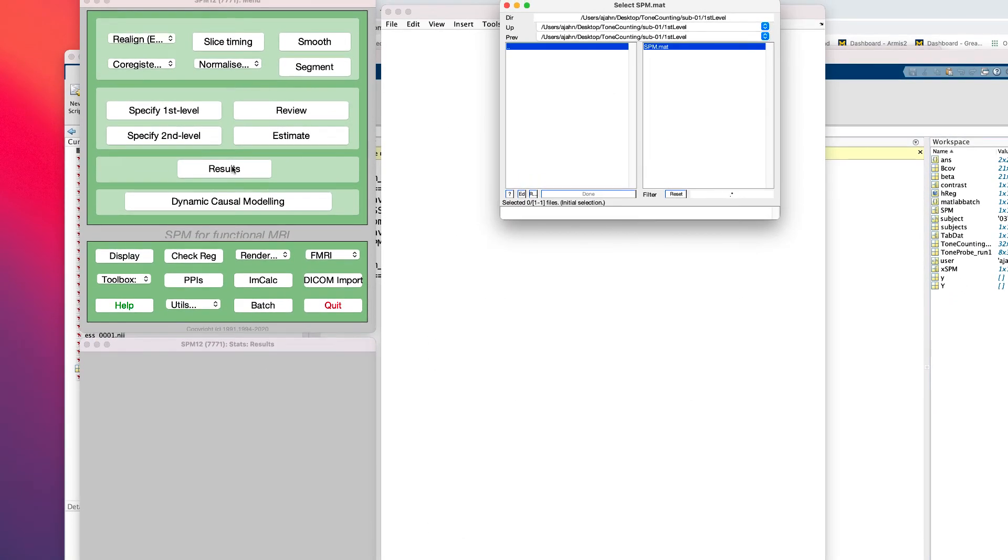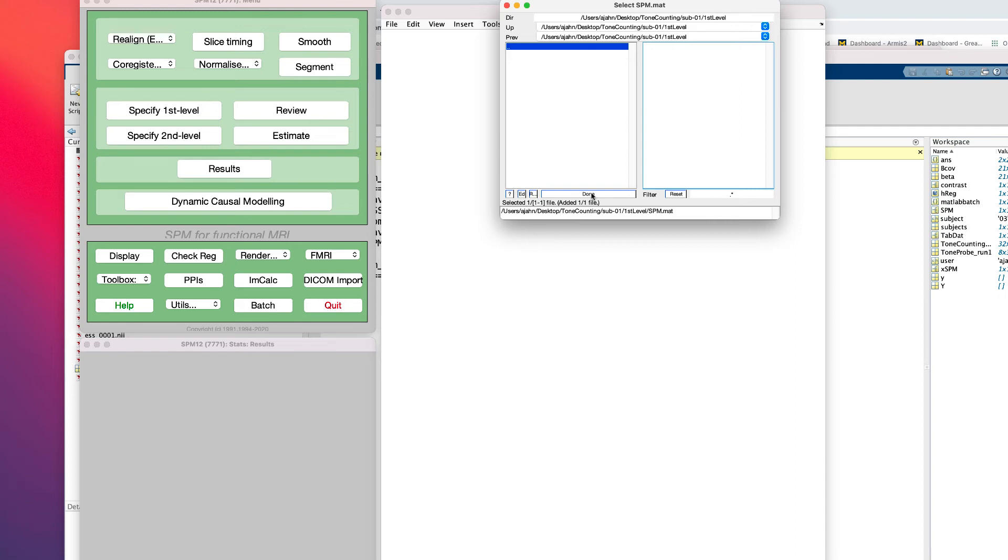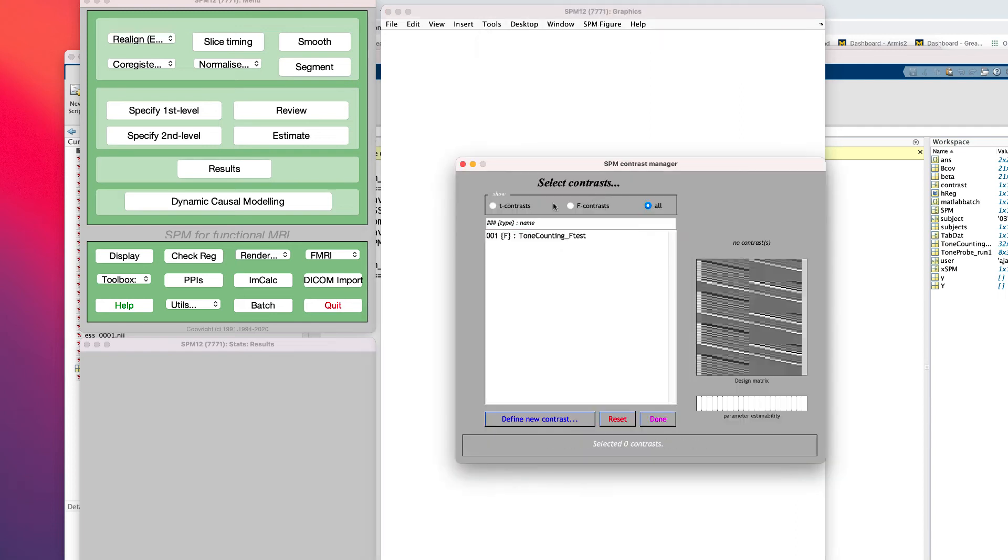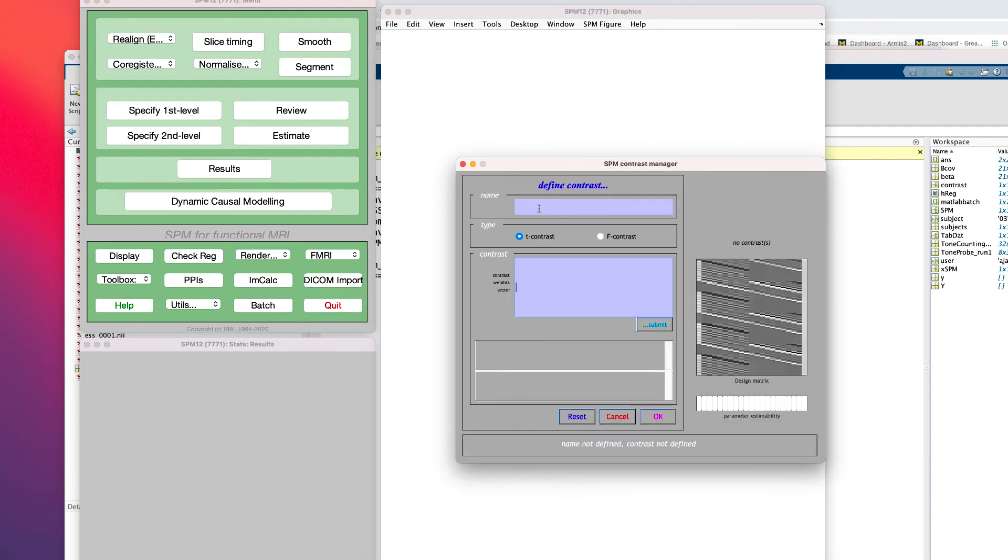Aside from an F-test, you may want to compare specific time points or combinations of time points against each other. Let's say we were interested in the average of TRs 3-4 compared to TR-1, and where this difference was significant.